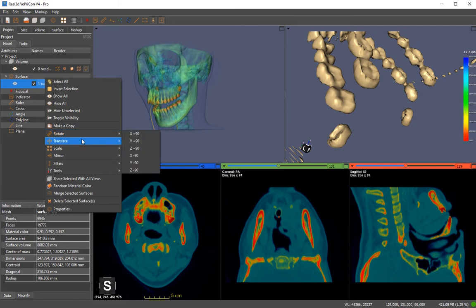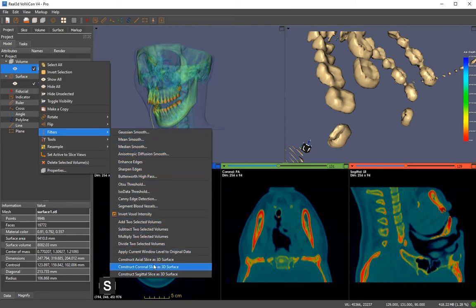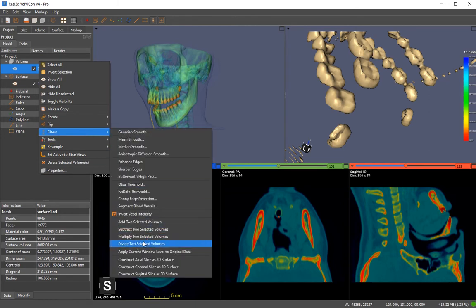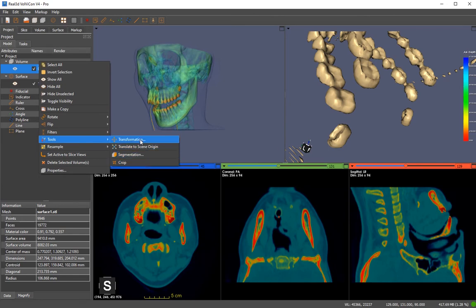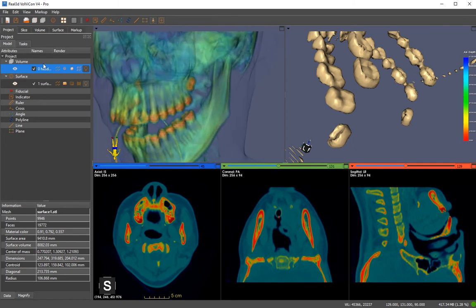You have different forge features for surfaces, and different filters and features for volumetric data — low-pass and high-pass filters to smooth data and sharpen edges, thresholding, and you can also reconstruct a surface from the filter result. If you have finalized the window and leveling you can apply the current window level to the original data, so when you export the data it will have the current brightness and contrast saved.